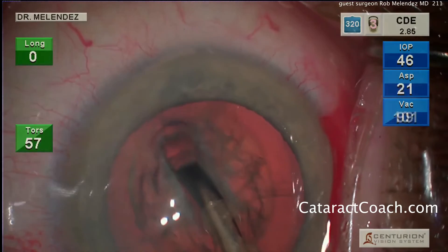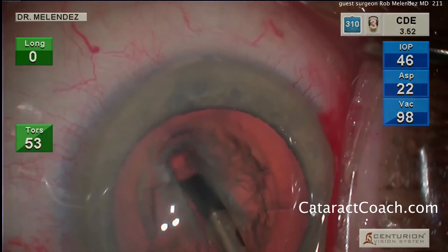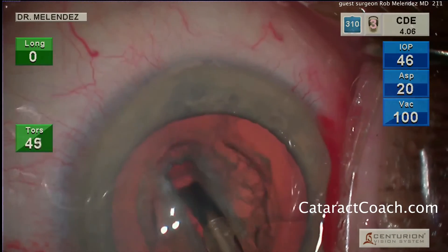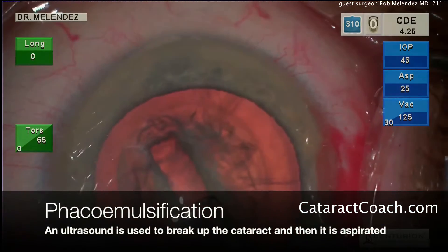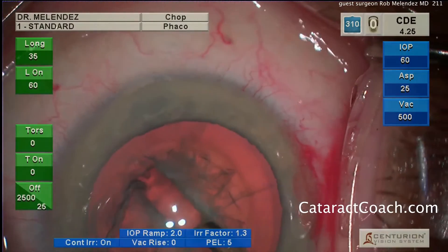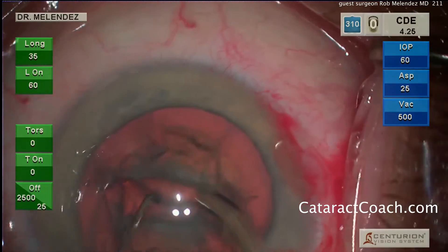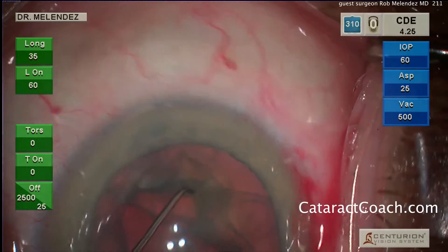Once the appropriate depth has been achieved, we can split the nucleus into two halves. You can see the red reflex coming through the bottom of the trench — careful not to sculpt too deep. Now it's time to split the nucleus. The phaco probe is in the right hand, chopper in the left. The lens is rotated and the pieces are split quite easily — once, twice, and maybe a third time to fully propagate that chop.